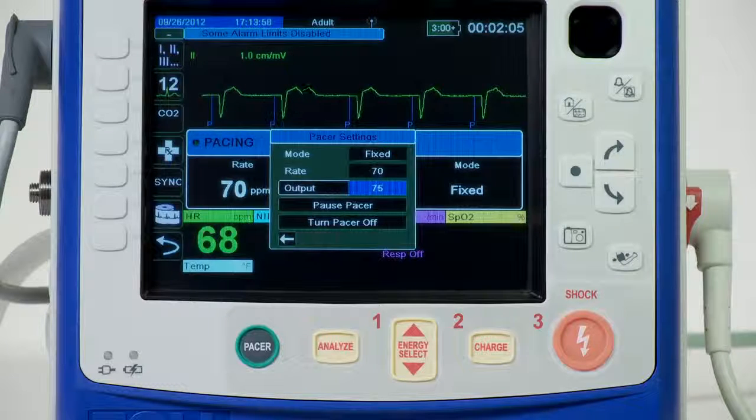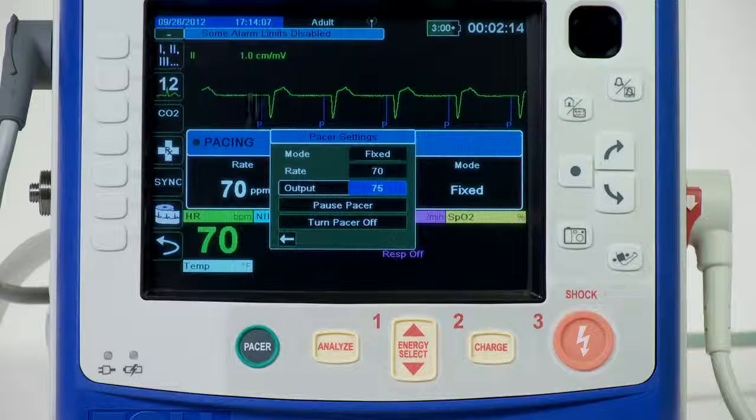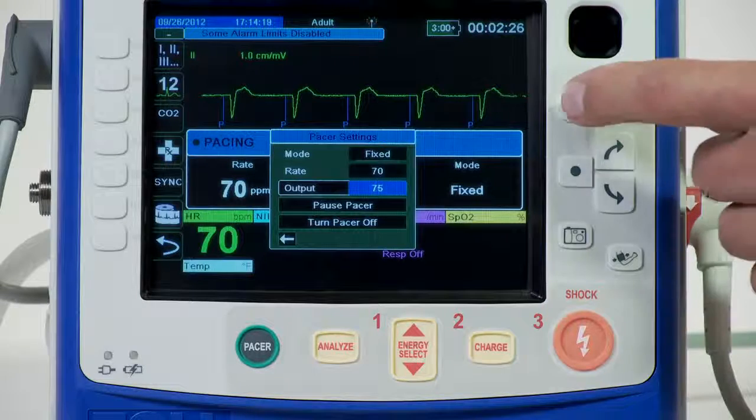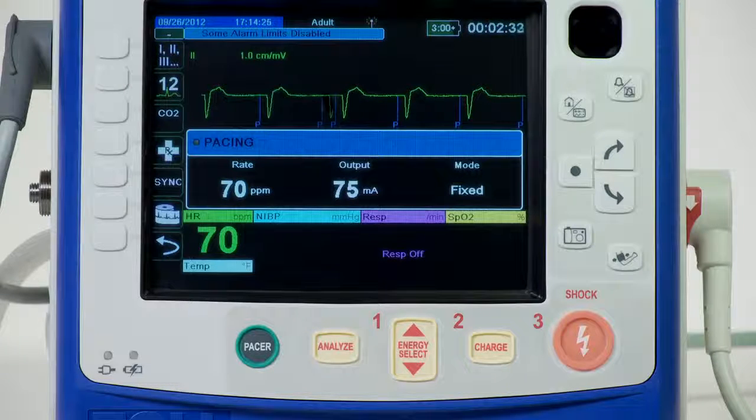It is important to recognize when pacing stimulation has produced a ventricular response or capture. Determination of capture must be assessed both electrically and mechanically in order to ensure appropriate circulatory support of the patient. Electrical capture is determined by the presence of a widened QRS complex, the loss of any underlying intrinsic rhythm, and the appearance of an extended and sometimes enlarged T wave. Ventricular response is normally characterized by suppression of the intrinsic QRS complex.